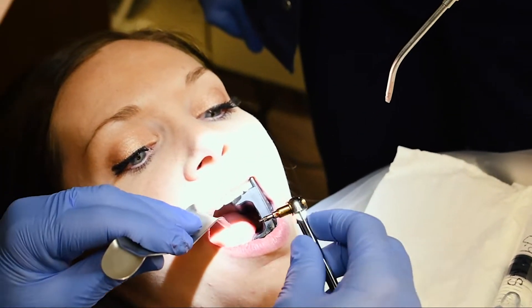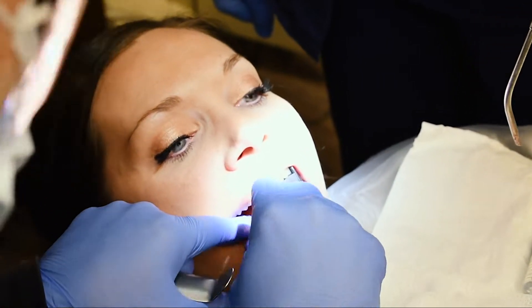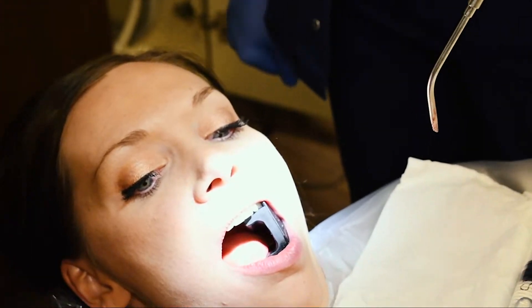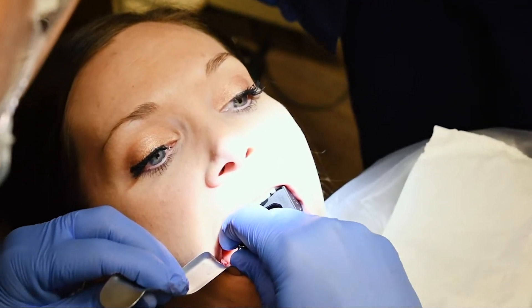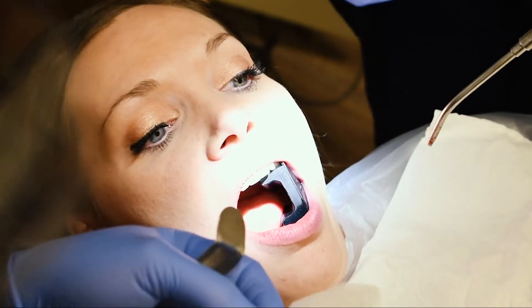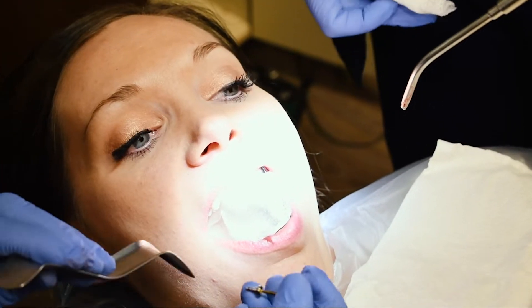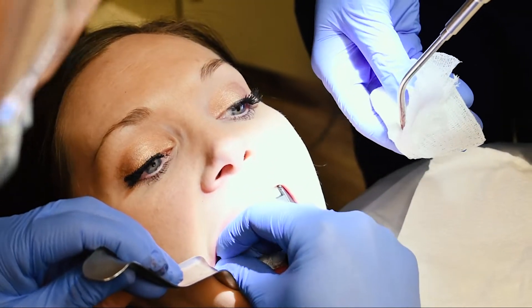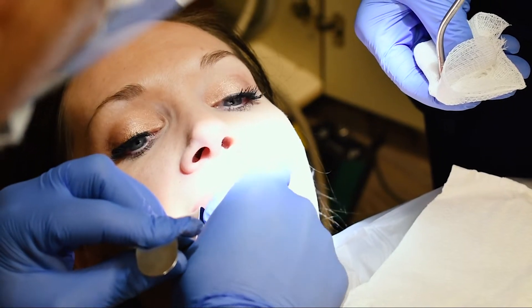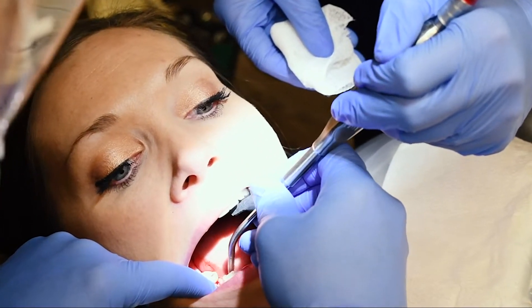Just looking at the depth, making sure I like it. Going just a little bit more. Now this is the healing abutment — I'm going to put the healing abutment on top of the implant. This is what you're actually going to feel at your gum line. I'm using the top of my Minnesota retractor on the hand wrench so that when I spin this down and let go it doesn't go anywhere. Now we need a stitch and we're done.